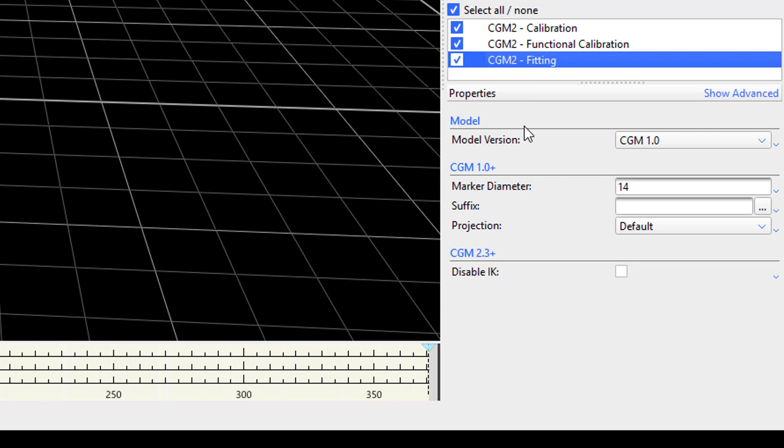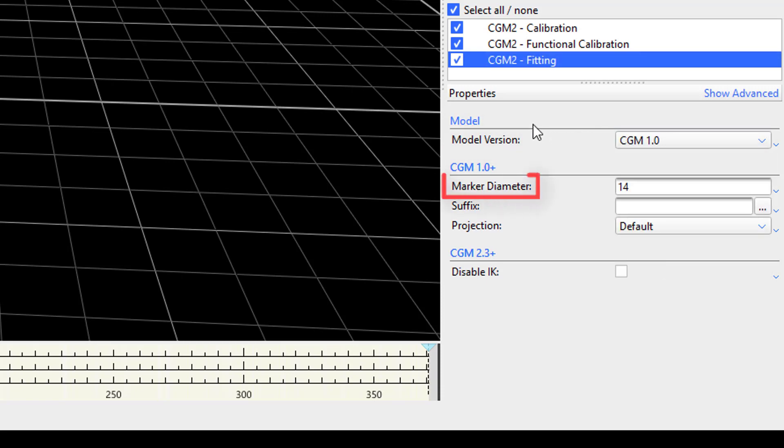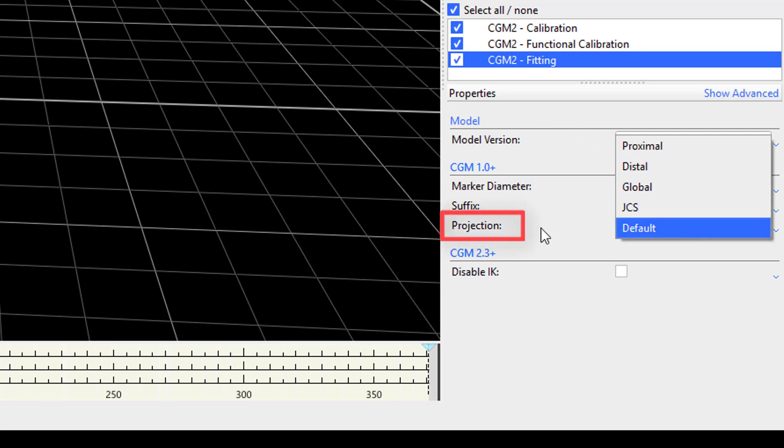CGM2 fitting pipeline will be used for all dynamic trials. Similar to CGM2 calibration, you can specify which model you want to use, specify the marker diameter, and add a suffix to your model outputs. You can also disable the IK model for all CGM2 models that are 2 and above. The one unique property here is the projection. This allows you to specify which reference system you want to use when calculating joint moments. Your choices are proximal, distal, global, or the joint coordinate system.